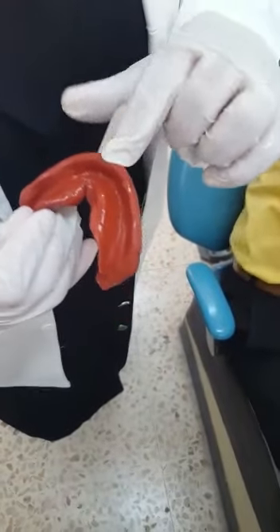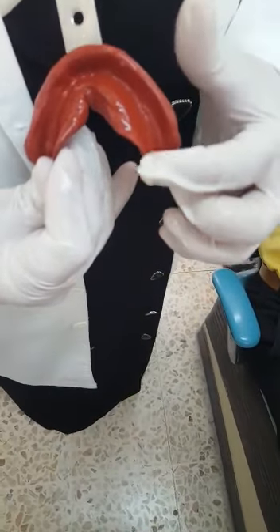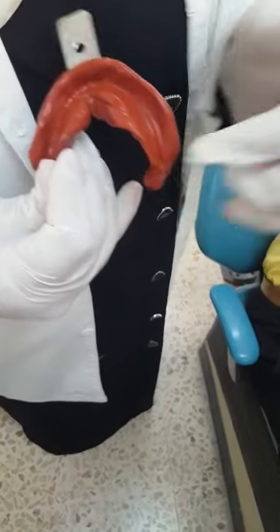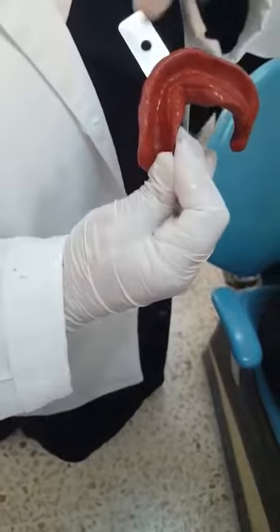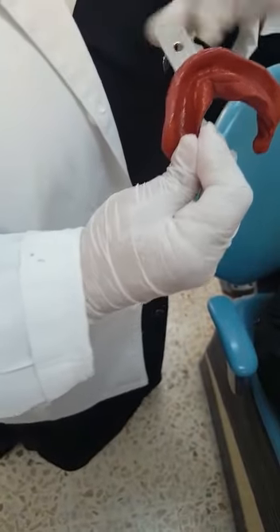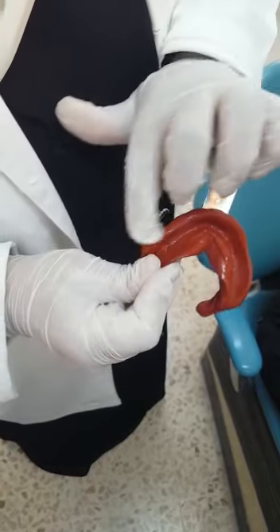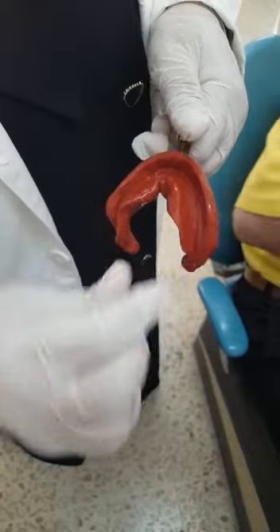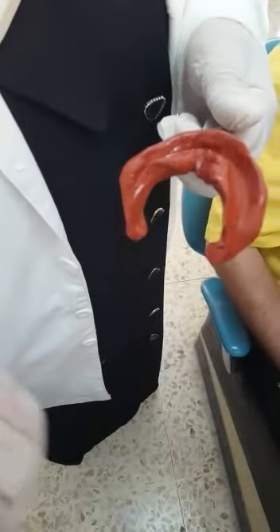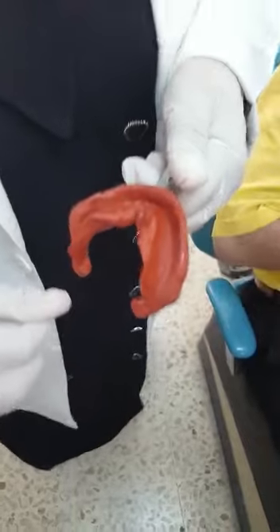Looking at the sulcus — I've taken it all. The lingual pouch here did not take it, although this is the largest size of tray, because the patient has a large ridge and this is the largest size of trays we have. The buccal sulcus all around is continuous and uniform. The lingual sulcus is short. To solve this, I bring some more material and build it up as if I'm doing border molding.